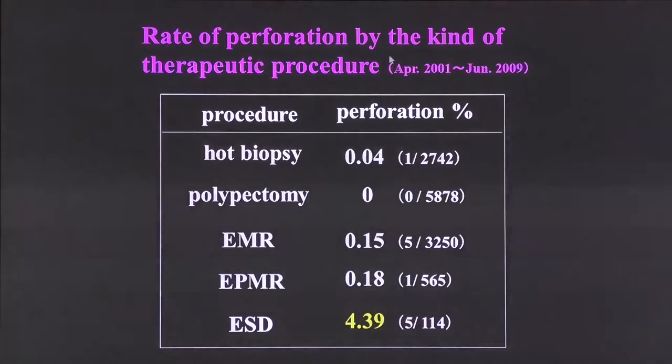But be careful because the perforation rate is very high in ESD. The data is a little bit old, but the perforation rate is still a little bit high compared with the other procedures.